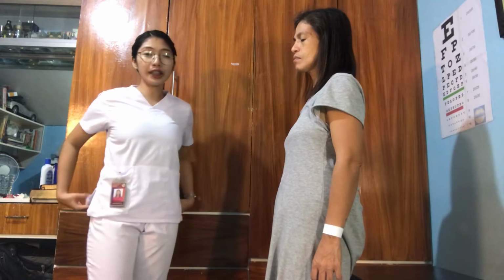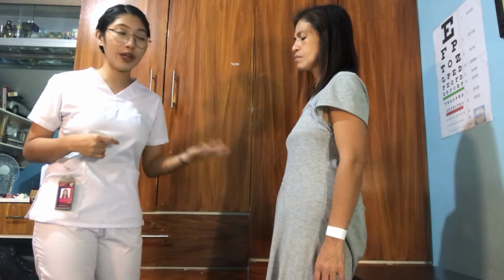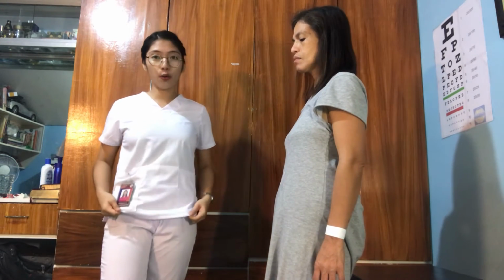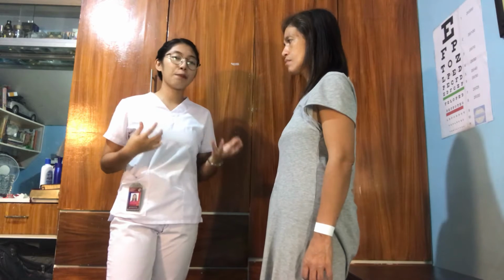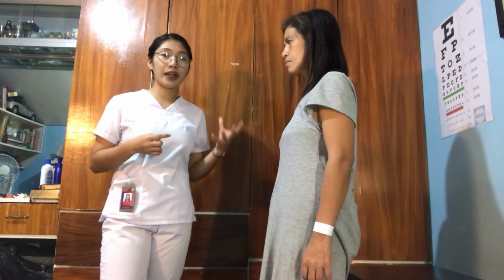So after measuring the height of the patient, we are now measuring the weight of the patient. So whenever we are measuring the weight, we need to make sure that the patient is wearing light clothing and does not wear any heavy accessories, so that we could be measuring the patient's accurate weight.